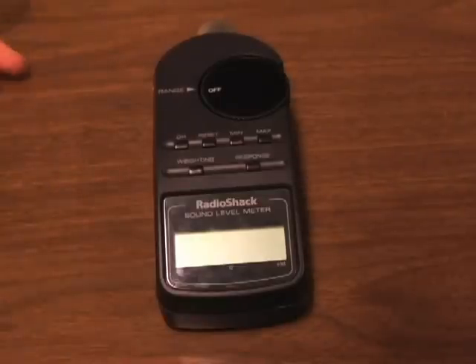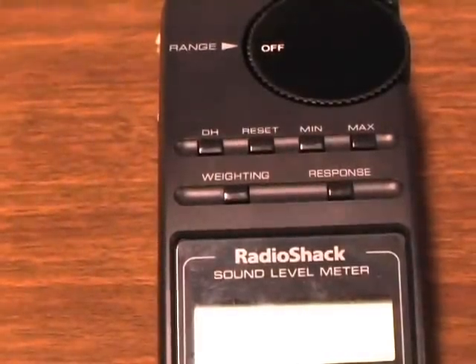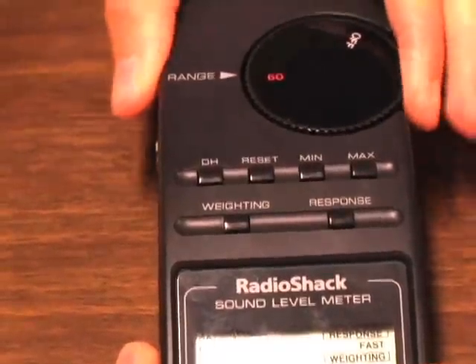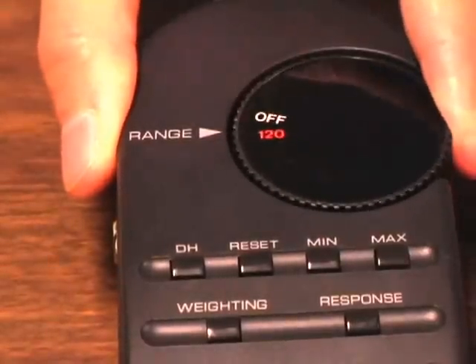The SPL Level Meter has a built-in microphone. The Sound Pressure Level Meter also has a range dial — it is a rotary dial that allows you to select one of seven ranges centered at 60, 70, 80, 90, 100, 110 dB, and 120 dB.